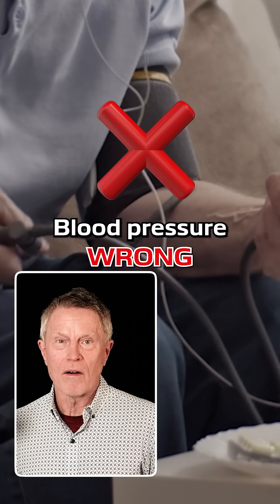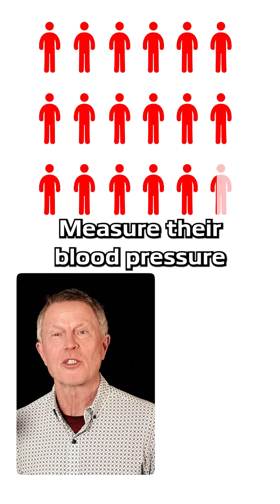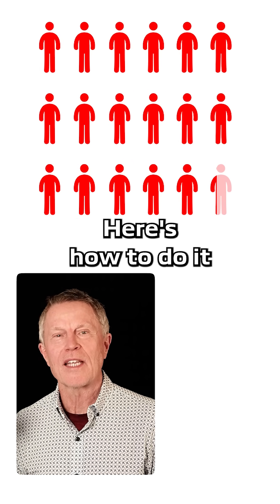You're measuring your blood pressure wrong. In fact, 97% of people measure their blood pressure wrong. But don't worry, here's how to do it.